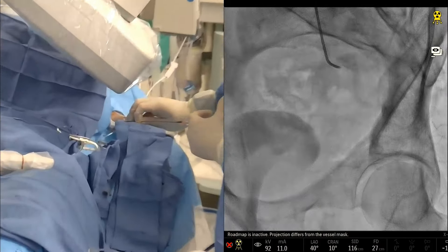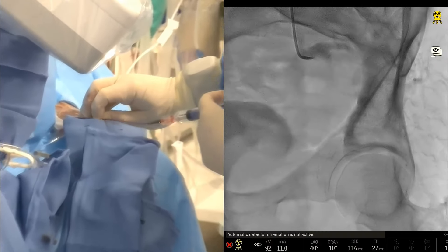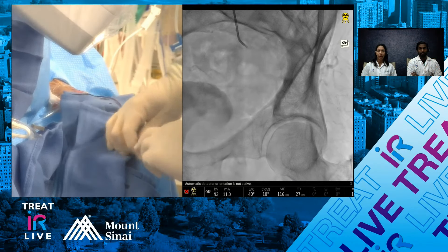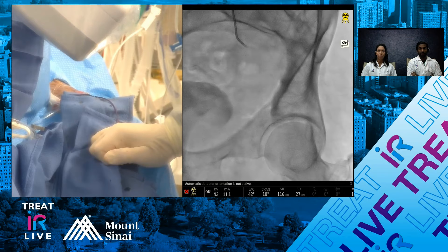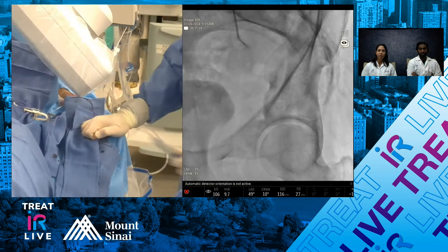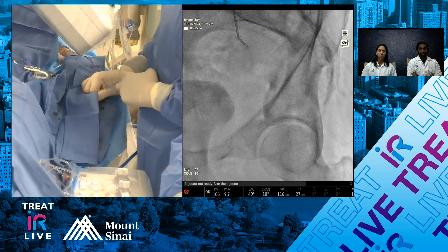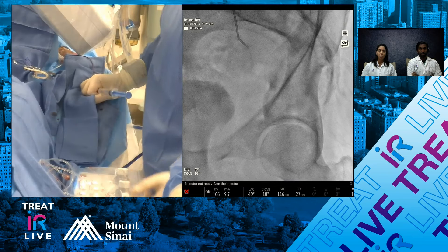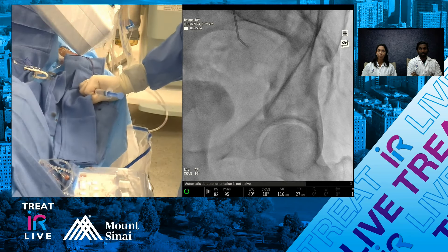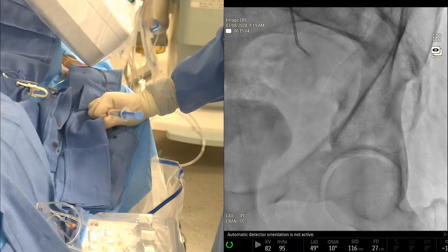Puneet had a great slide showing the escalation approach. So you're looking at this angio — are you thinking that balloon occlusion is still the way to go, or are you concerned that you may not be able to track it into that very tortuous prostatic origin? I think we can get it in, no problem. So we're going to use the sniper, I think, to start on this side.